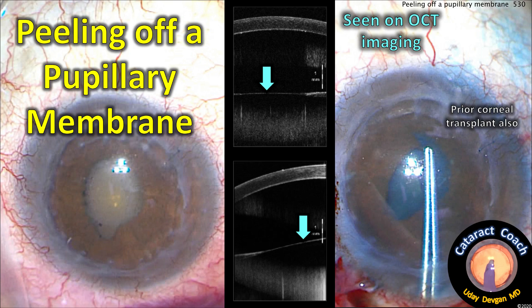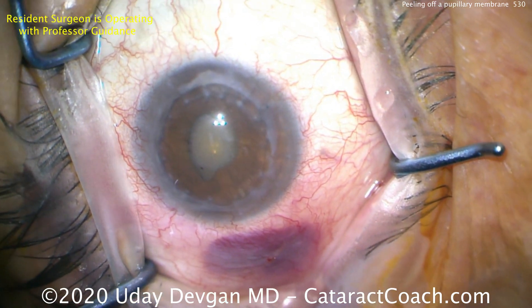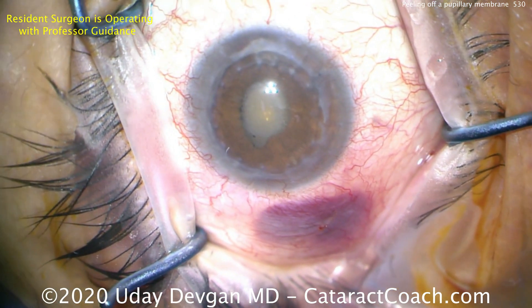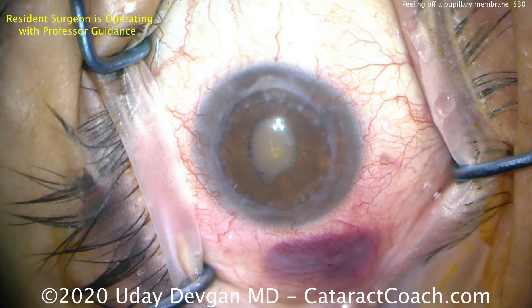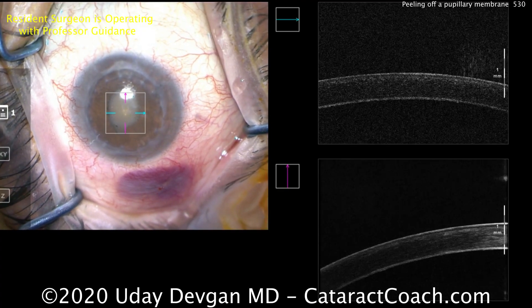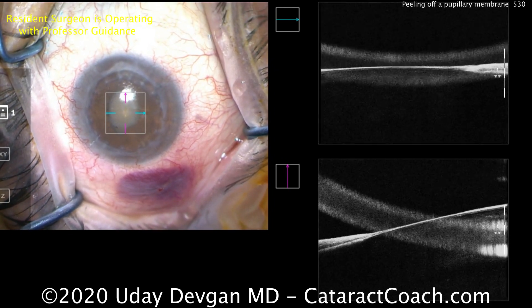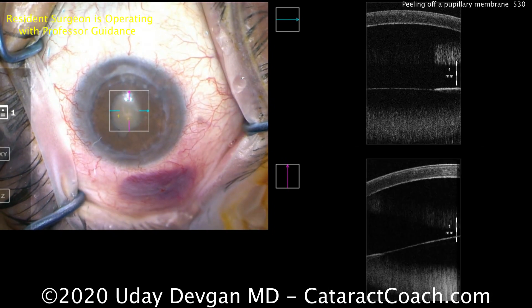Cataractcoach.com — peeling off a pupillary membrane in an eye with a prior corneal transplant. I have OCT imaging to show you too. The eye had a corneal transplant many years ago, a dense cataract, a pupillary membrane, and a lot of synechiae. Here's the OCT scan — there's the cornea, and if we zoom down a little bit, there's the iris as well as the membrane coming across.